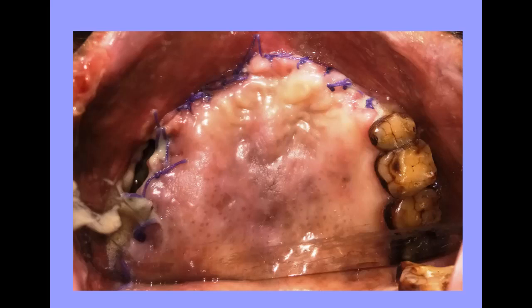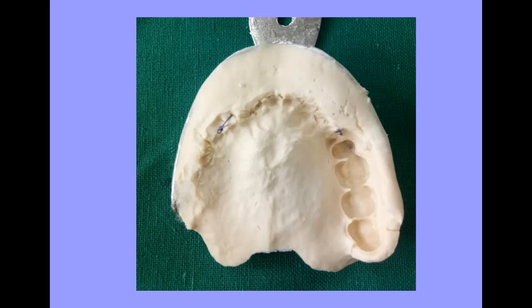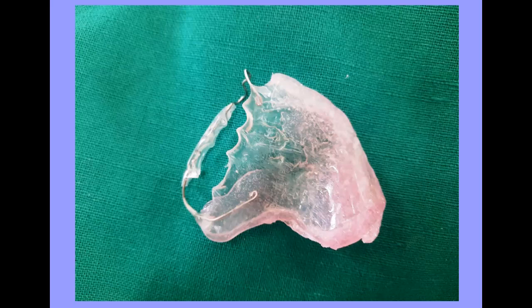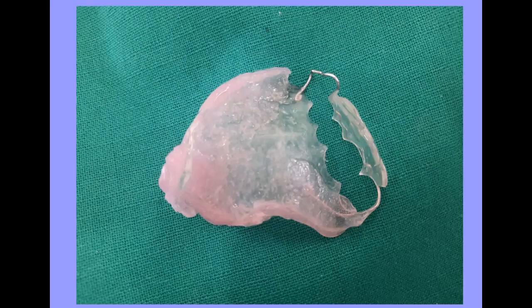This is a case of mucormycosis which was surgically treated and primary closure was attempted but not properly achieved. You can see there is difficulty in prosthetic rehabilitation because you need to totally depend on the residual maxillary teeth, as there is no defect cavity available which can be used as a retentive measure. For such defects, you can fabricate plates where incorporation of a soft tissue lining of silicone material can be done to make them more stable and retentive.